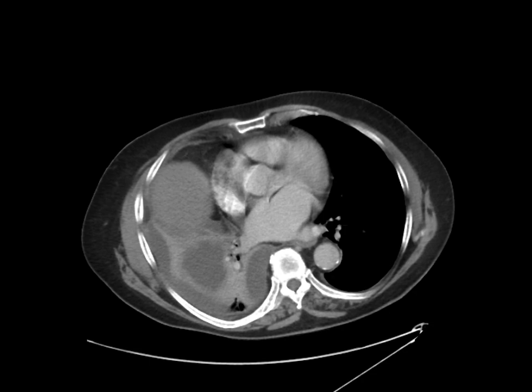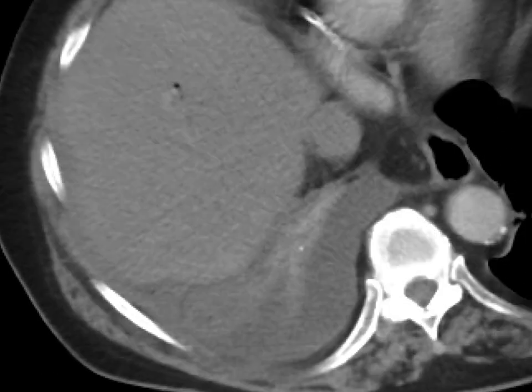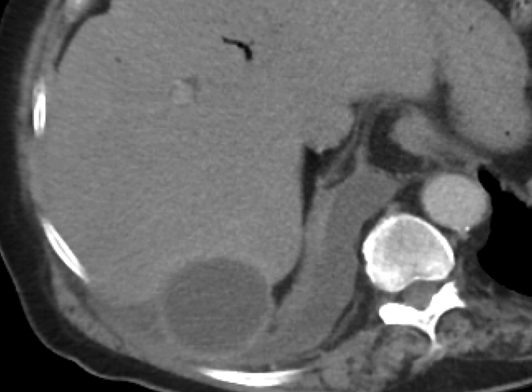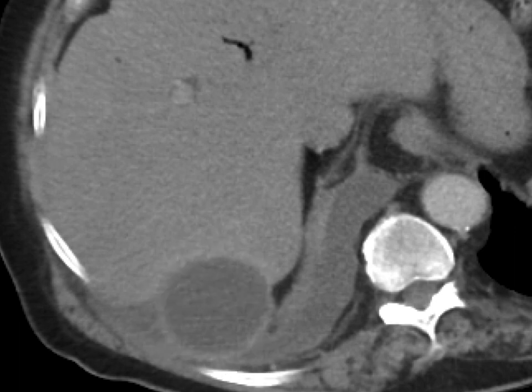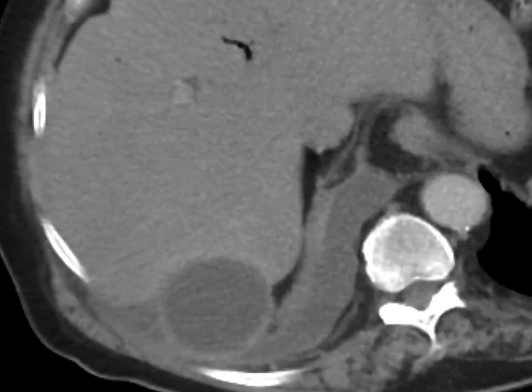This is a patient with abdominal pain and fever who gets a CAT scan. As we scroll down, we can see that there's this thick-rimmed collection here in the hepatorenal recess, also known as Morrison's pouch.